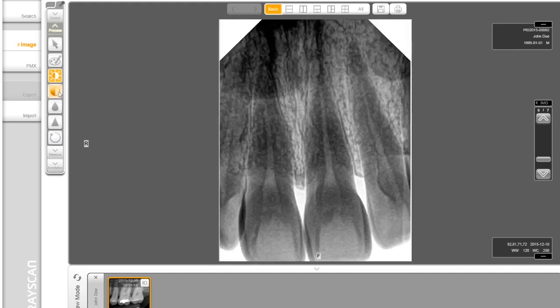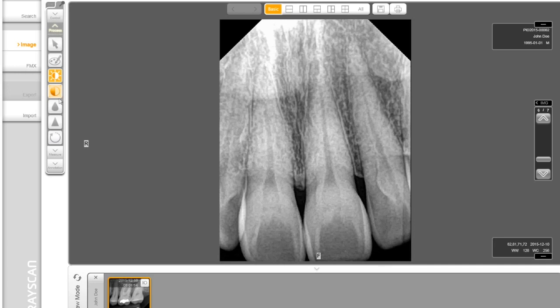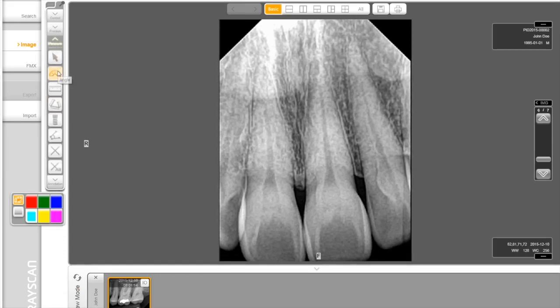Invert makes whites to black and blacks to white. You also have Sharpen and Median options. Below that, you can do angles under the Measure section. You have a standard single line measurement, and a single left click will start and stop. Also, you can do a multi-line, or tape line, so you can do multiple measurements.